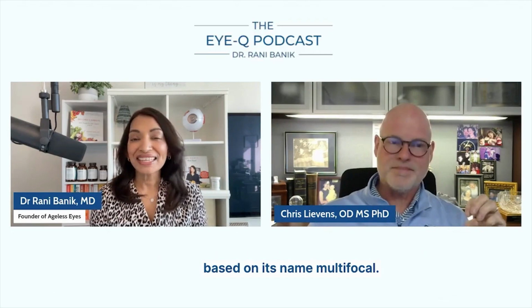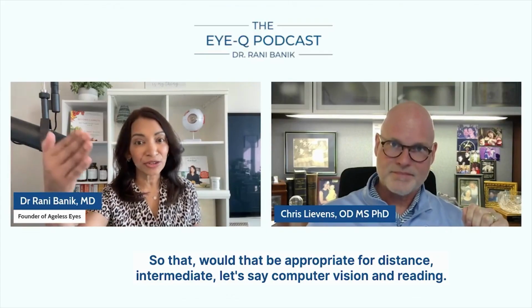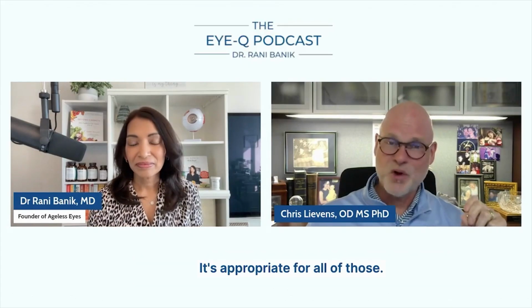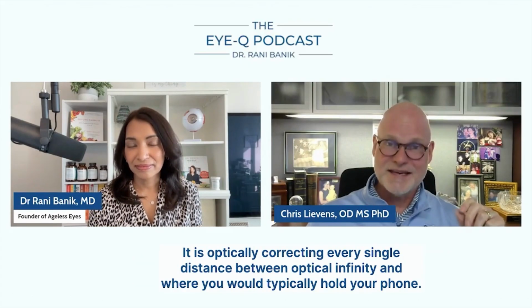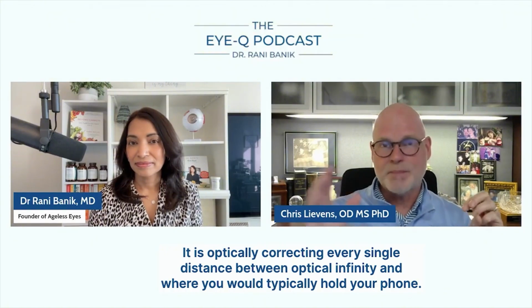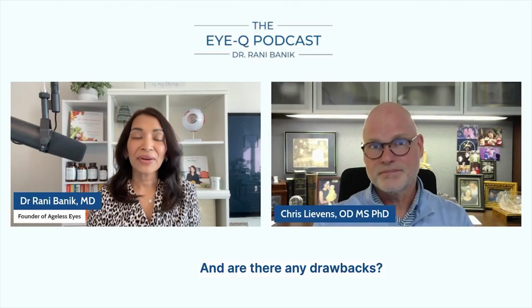Based on its name, multifocal, would that be appropriate for distance, intermediate, let's say computer vision, and reading? It's appropriate for all of those. It is optically correcting every single distance between optical infinity and where you would typically hold your phone. And are there any drawbacks?